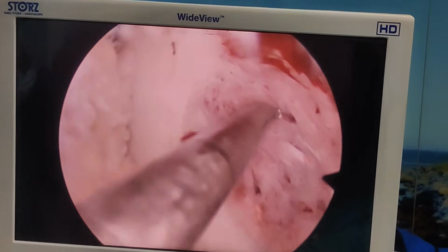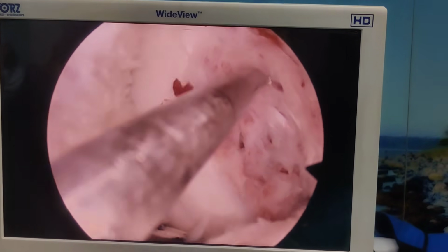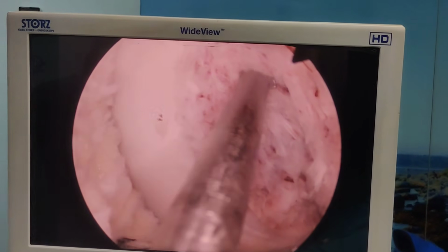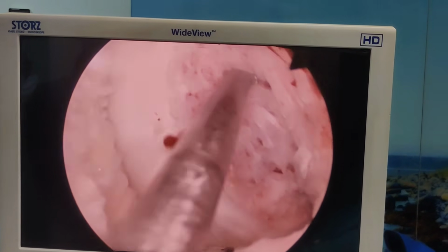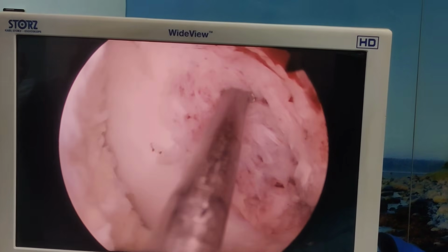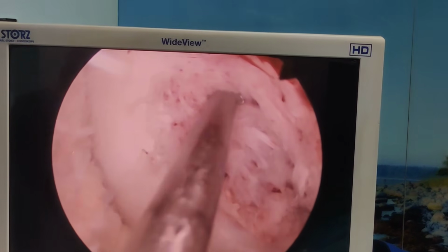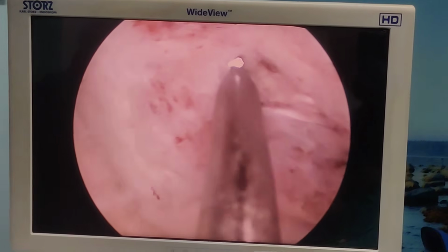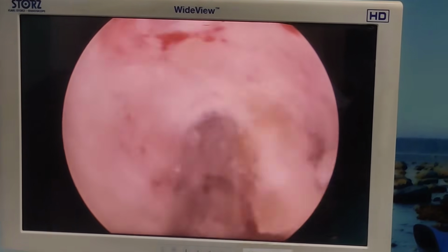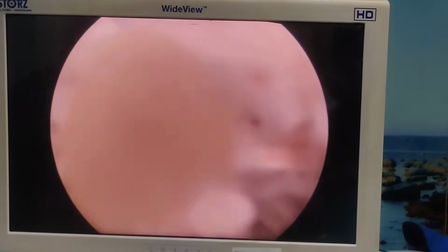So if you see here, we are right up and very close to the articular surface. So this is the area where the anterolateral bundle is. So we are just going to make a drill hole. First we are going to go through and through with the beath pin, and then we will use an 8 mm drill bit, because our graft is 8 mm. Chalo. So once you drill, the knee should be at around 90 to 95 degrees of flexion. You don't want your knee to be extended.